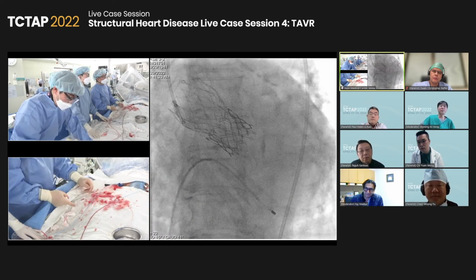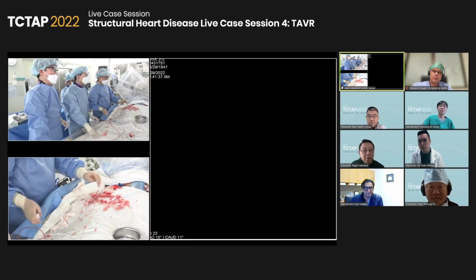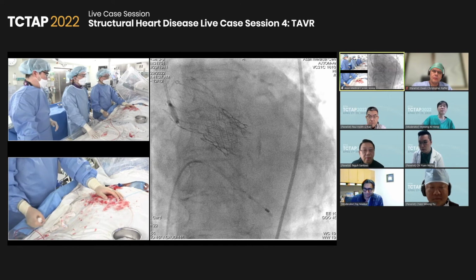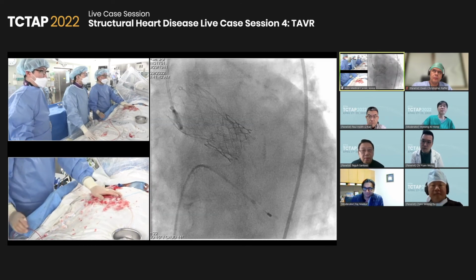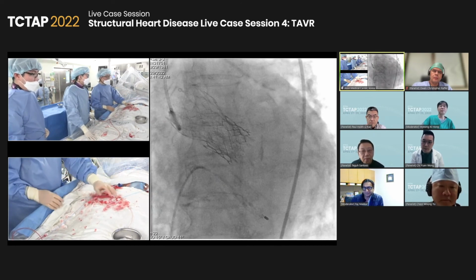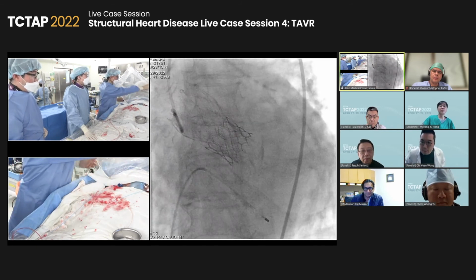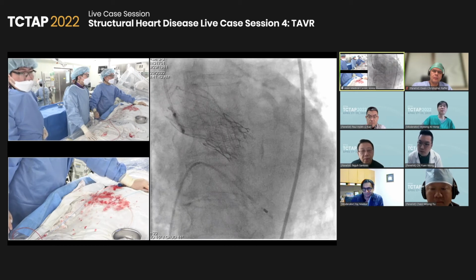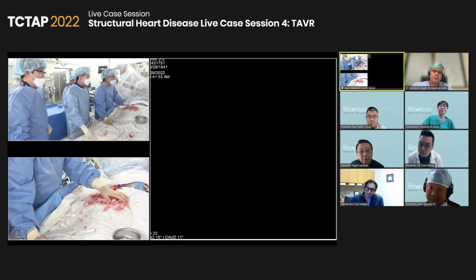And absolutely, many physicians are concerned: how do we keep the anti-thrombotic strategy for such a valve-in-valve case? Although this patient is an AF patient, we absolutely require oral anticoagulation. Okay, and you're ready? Here we go. Full shot.